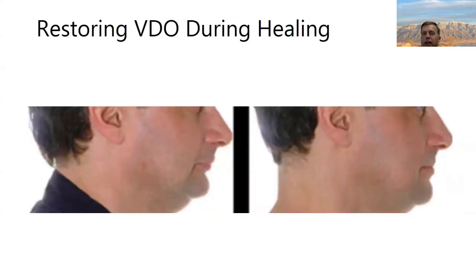Here's my video picture again. Why do we have it here? The reason is that I would argue that the best time to take a big swing at things is with the provisional prosthetic. The reason is because we have that built-in evaluation period, and we're changing the person's whole mouth anyhow. Even if we didn't change anything, there's going to be a certain amount of adaptation involved.